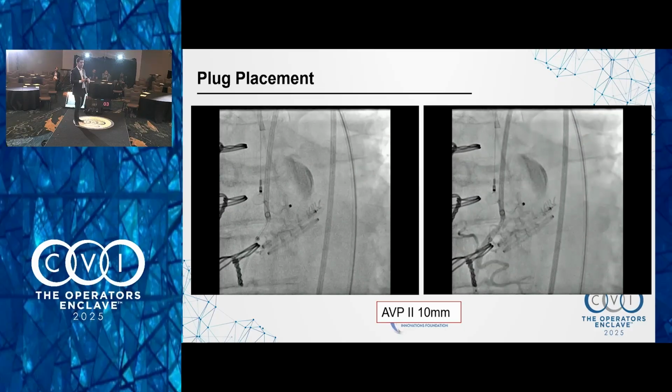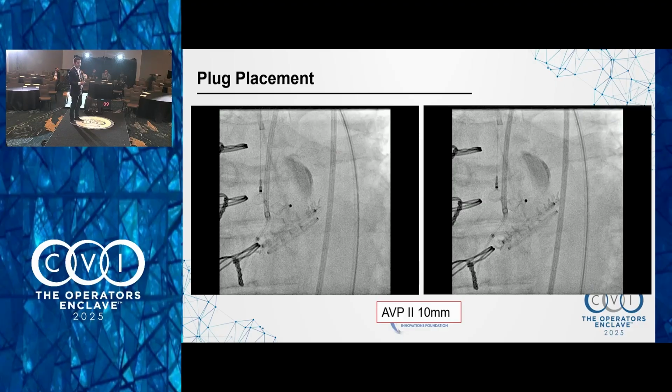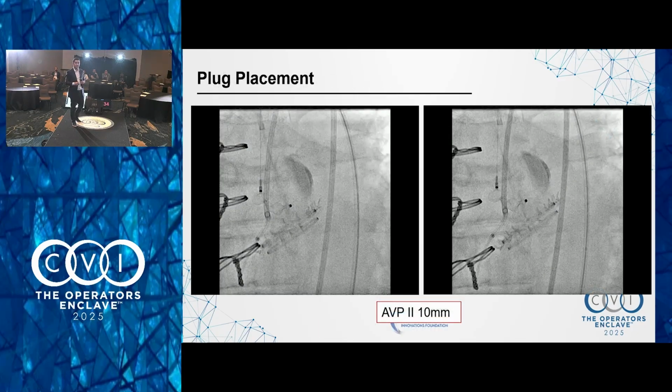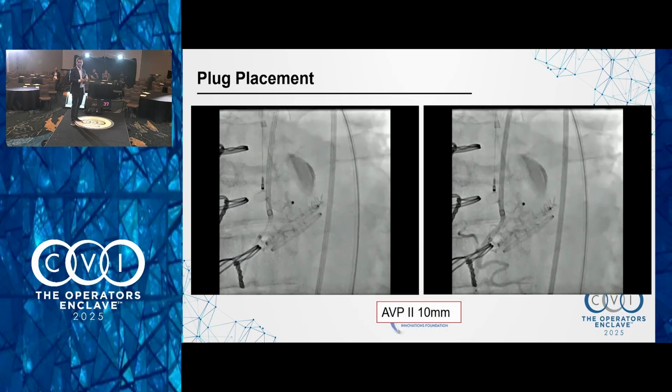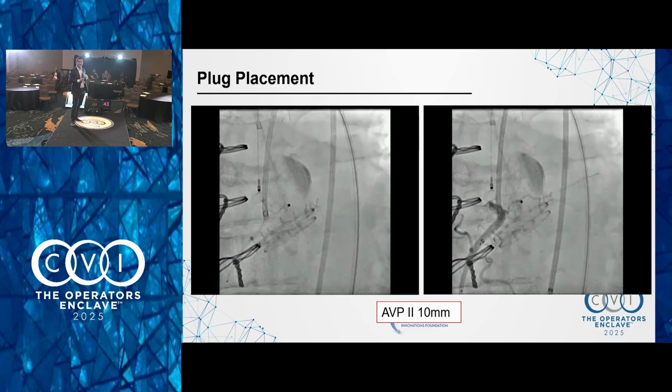I knew it was going to overhang. Why not put the 2 lobes into the aneurysm and 1 lobe outside? That's what I would have done. Ideally, I would like to get the max compression of that pseudoaneurysm with the body of the AVP2, instead of just having the little spacer covering the pseudoaneurysm. He's worried about the disc being too close to the right coronary. There may not be enough room for the proximal disc to fully expand also, because it's in that little space. It's hanging out further than it would be if it's pulled in. Exactly.